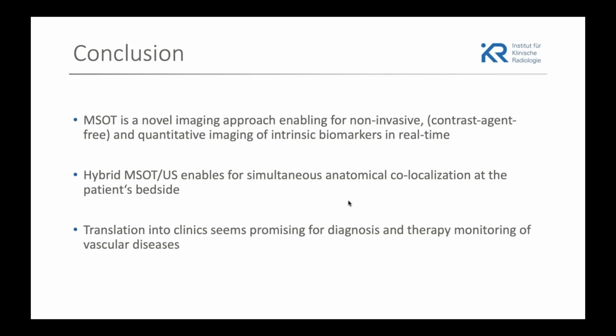For us clinicians, it's very promising that this happens in real time, as we are used to from ultrasound imaging, which you can use in this hybrid approach for your anatomical co-localization, making it easy for us to apply MSOT imaging in our routine, or I hope it will be easy for us to apply this in the future.